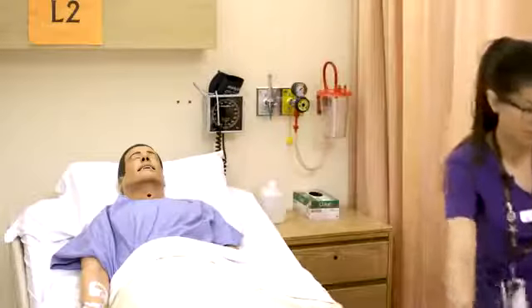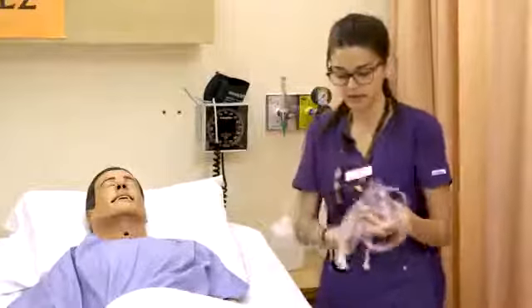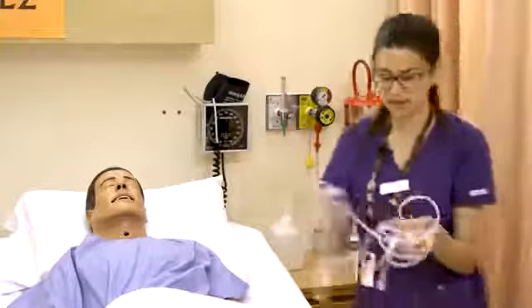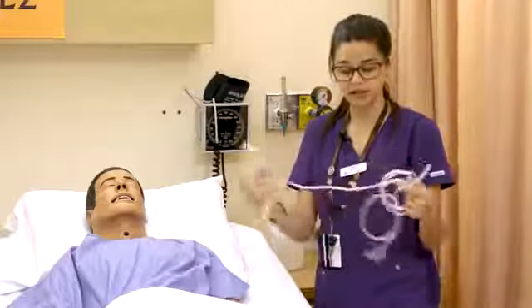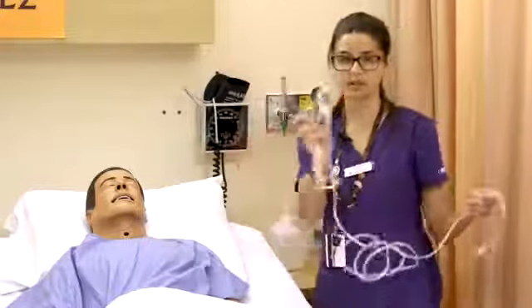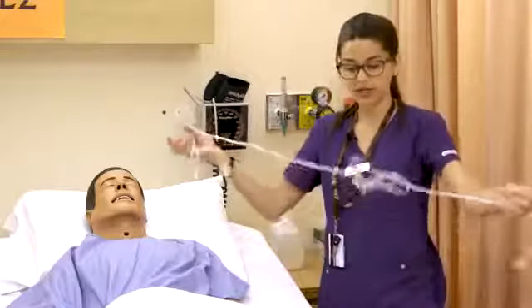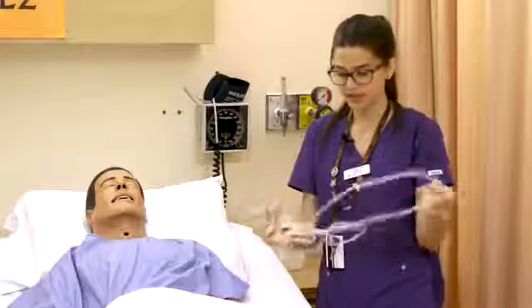There's one other mask that we'll show you, the Oxy mask. This one is pretty neat because it can go from a low flow of 1 liter per minute to upwards of 15 liters per minute. So this one delivers a wide range of 24 to 90% FiO2. Hers is a little bit tangled.